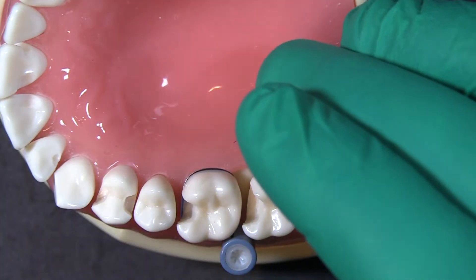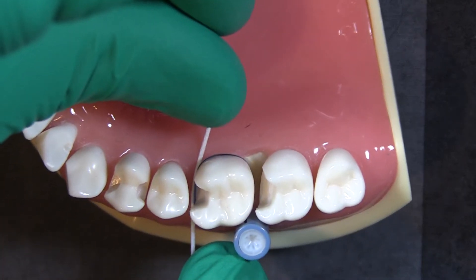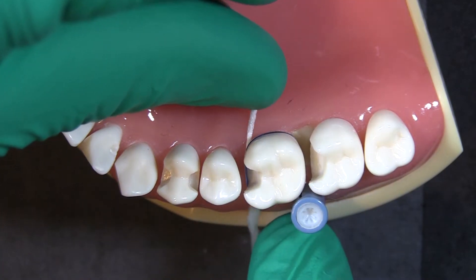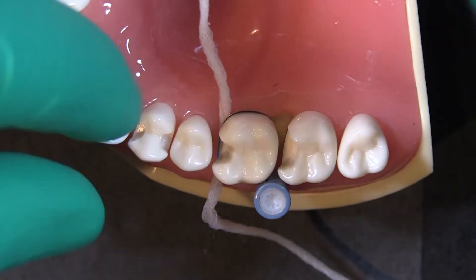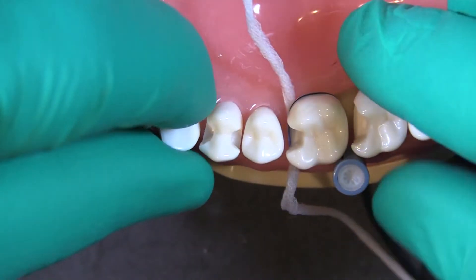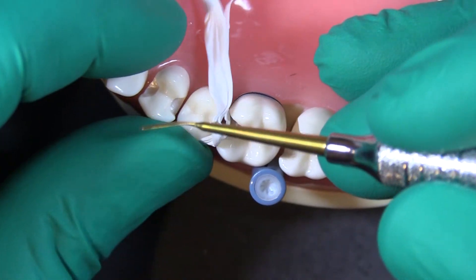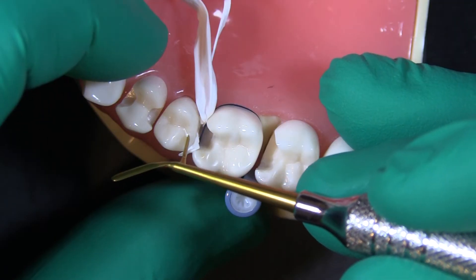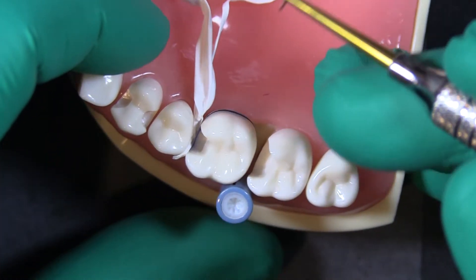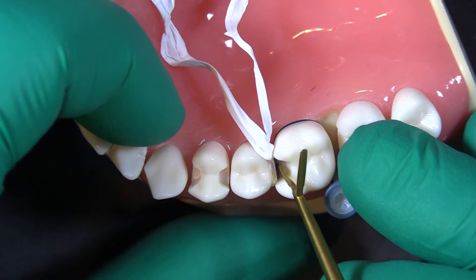One option is Teflon, and we also have super floss. You could take some super floss — nice and puffy — and gently tuck that in to give some extra pressure in that area. If that's not working because there's not enough pressure from the super floss and there's still a little indentation, we can take a little bit of Teflon and work it down where it needs to be. This is to help shape the emergence profile of the tooth in the subgingival area, so we pack that in to make sure we have that seal.